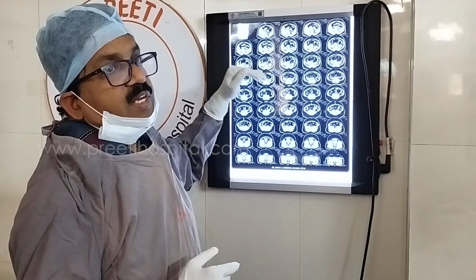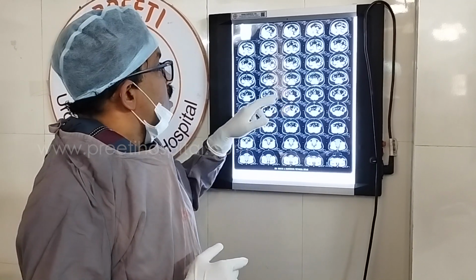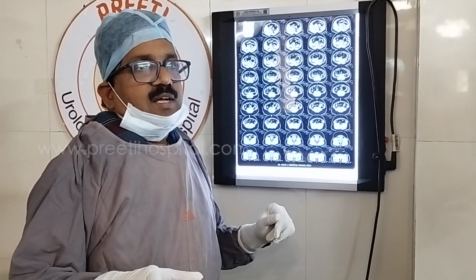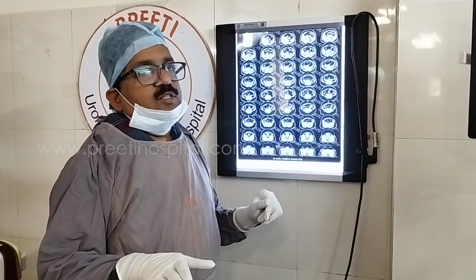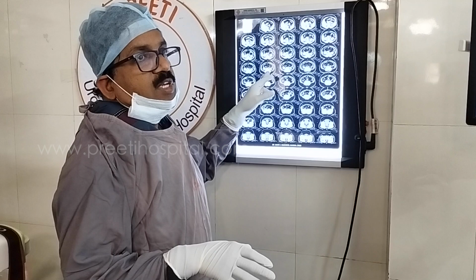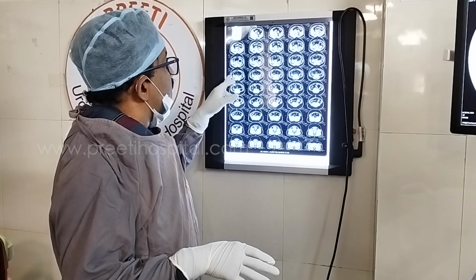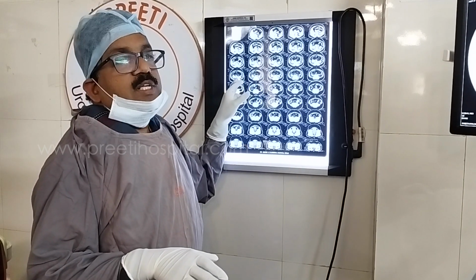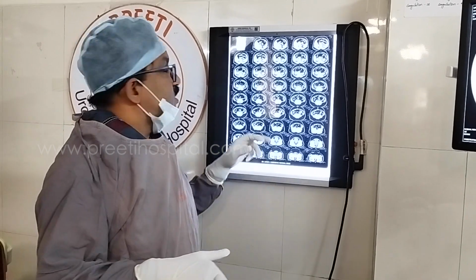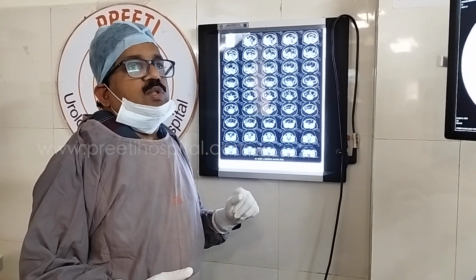If it is higher, if the kidney is not seen here, then you have to go intercostal for middle calyx. So if the kidney is below the rib, definitely you can go from below the rib, because it's an oblique tract. Horizontal, but you can go oblique tract also, as far as lower calyx. That too, the most medial part of the rib you don't go. As the rib end goes lateral, see the pelvis is there. That is also inferior to the rib, because you will be in the mid-axillary line or posterior axillary line. Posterior axillary line comes somewhere here, at the level where the 12th rib tip is there. That means you can go below that.